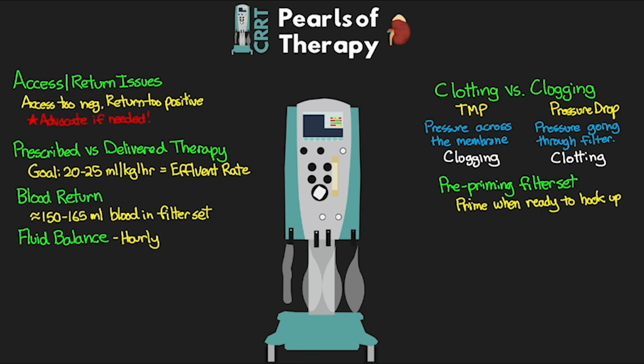And so it's really important that you don't miss anything. You've got to make sure that you're thinking of all the flushes that you do, any drains that they might have. Make sure you include all of those. Now, in order to get the most accurate volume that's infused through the pumps, if you have the ability to do so, make sure you pull that exact volume that's infused. A lot of the pumps are able to go in there and look at how much volume has actually been given and then reset that number, so that when you do your next check in an hour, you'll have the exact volume that was given.